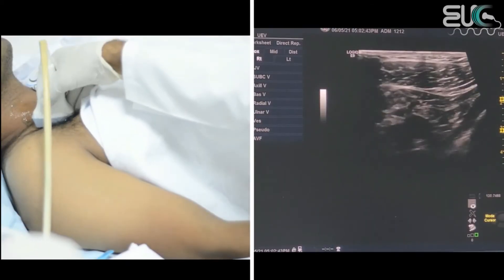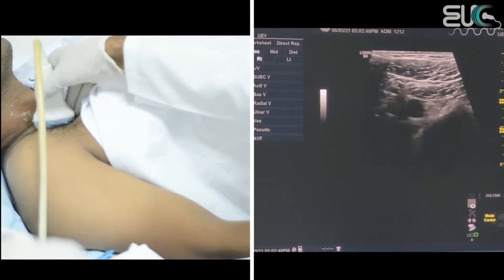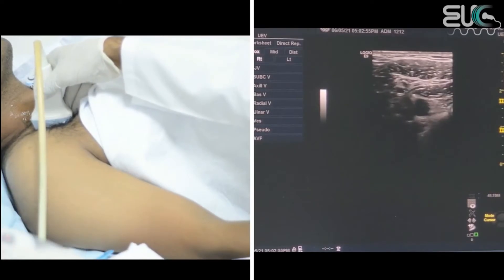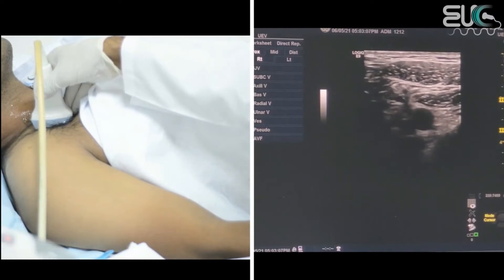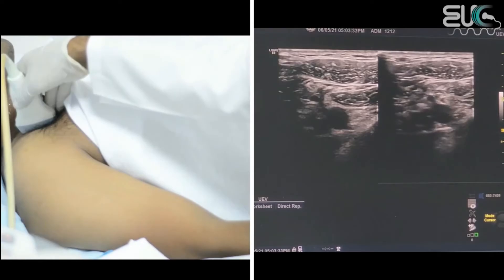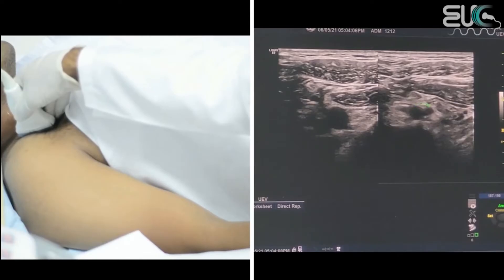After that, I will move to scan the subclavian vein by putting the probe at the infraclavicular region. On the screen, we have two vessels — one will be the subclavian artery and the other will be the subclavian vein. In order to check compressibility, you have to ask the patient to take a deep inspiration and hold it. As we can see, the vein is totally compressible.